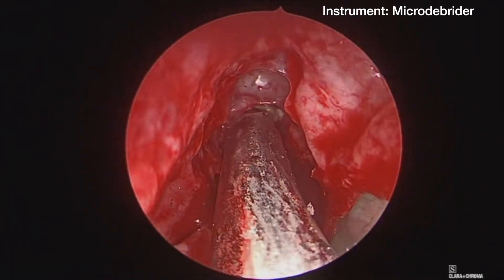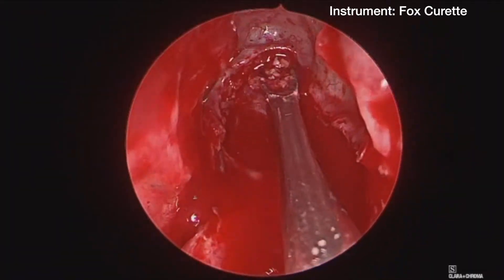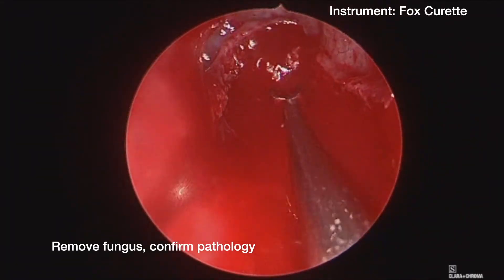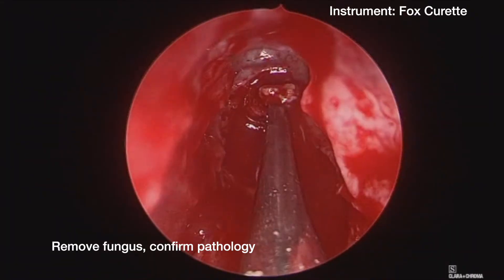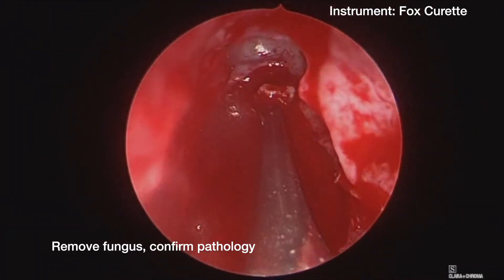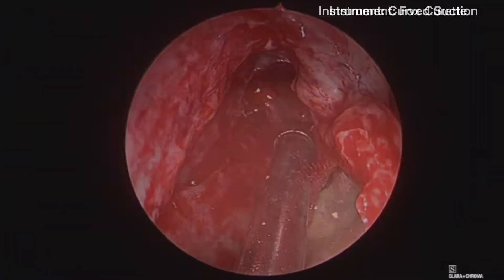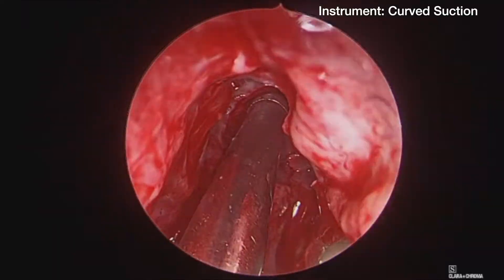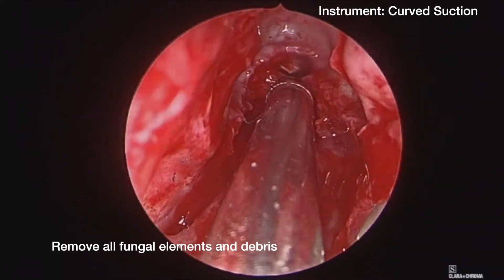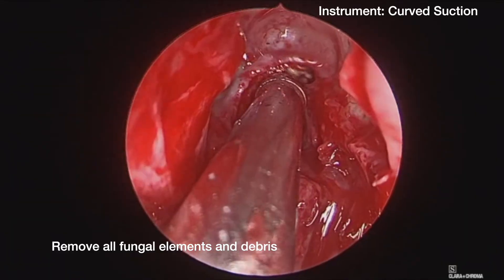After the area is expanded, a curette is then used to collect some of the specimen, which is sent for pathologic confirmation. Fungus balls are almost always Aspergillus species, which on pathologic analysis have acute angles and septate hyphae, further confirmed on GMS staining.